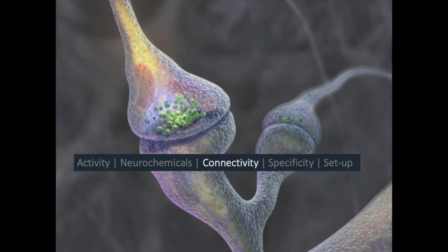how the brain works. It's important to say that we did do the stimulation in the scanner. You can, of course, do some imaging, take people out, do the stimulation, put them back in again, and that's fine, and it's a lot easier in a lot of ways, but you lose a lot of time, and it's very difficult to reposition people properly. So if you want to look at after effects of these things, you usually want to do that in exactly the same brain region that you looked at your baseline measurements in, and usually pretty closely to the end of the stimulation, and it usually takes 5 or 10 minutes, even if you're really efficient, to put people back in the scanner. So whilst we have done TMS, for example, outside the scanner and then put people in, it actually brings its own issues. So it's not necessarily a simpler way of doing it, though it is possible.